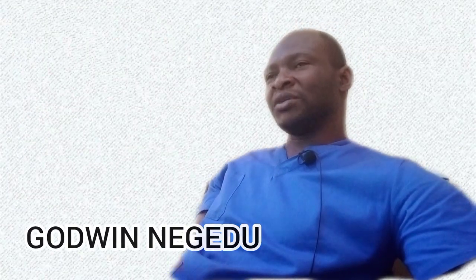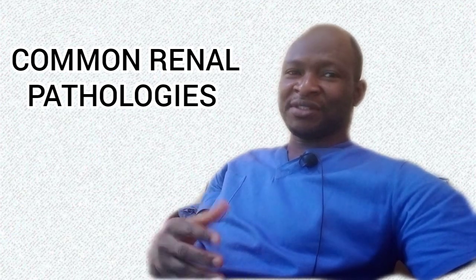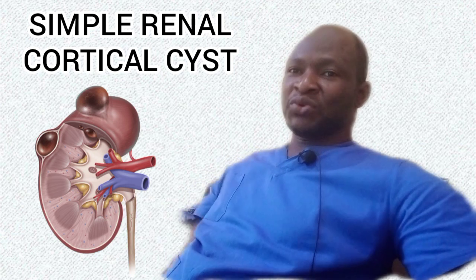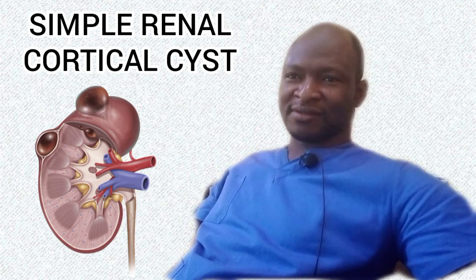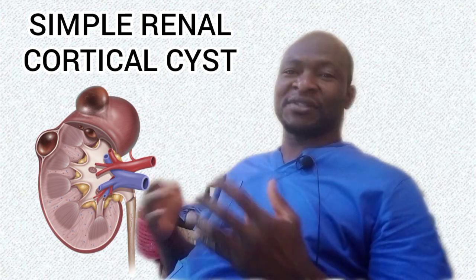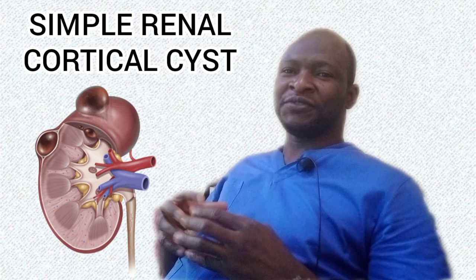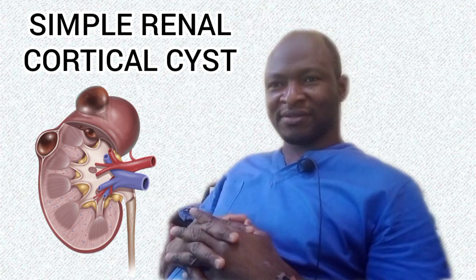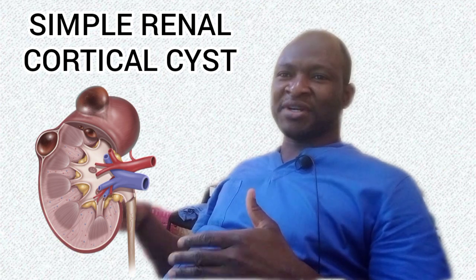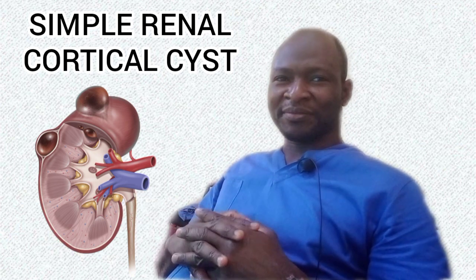So today, as we continue on our common renal pathology series on ultrasound, we'll continue this journey with simple renal cortical cysts. Simple renal cortical cysts are congenital true cysts that have serous epithelial lining and are fluid-filled benign cystic cortical masses. Commonly, they are seen after middle age. Half of adults older than 50 years have simple renal cysts.